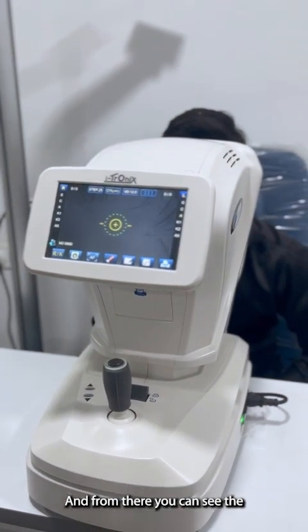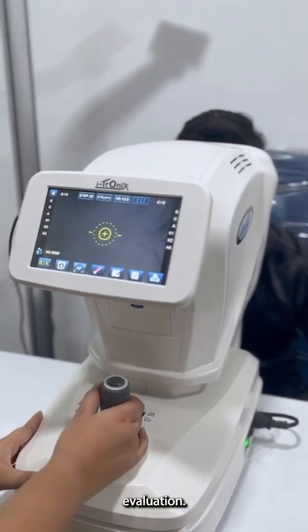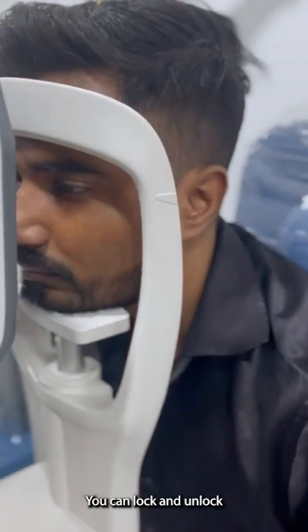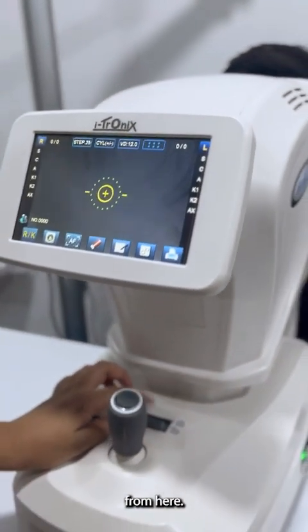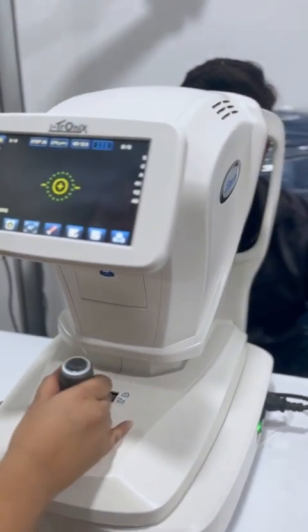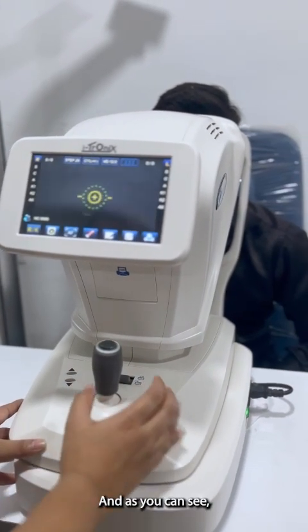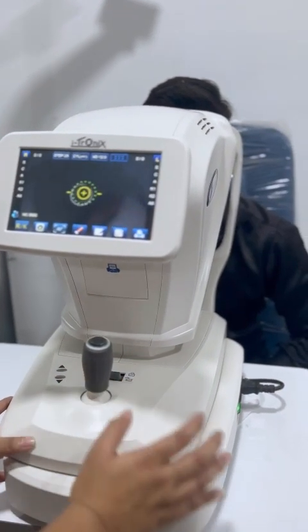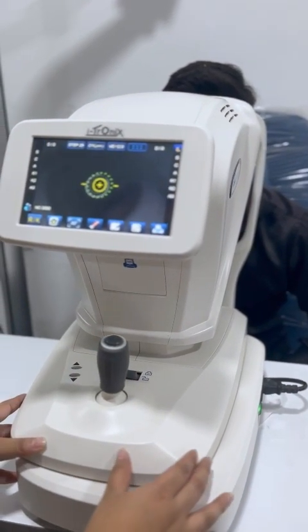Now I will show you some evaluation. From here you can lock and unlock the movement. As you can see, it is taking autofocus — I haven't touched anything.